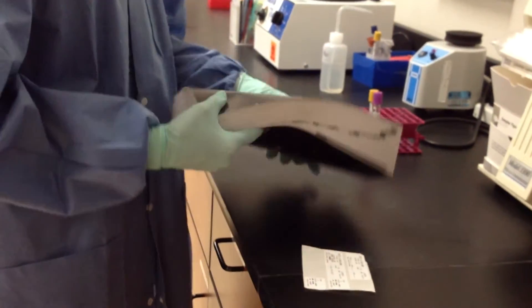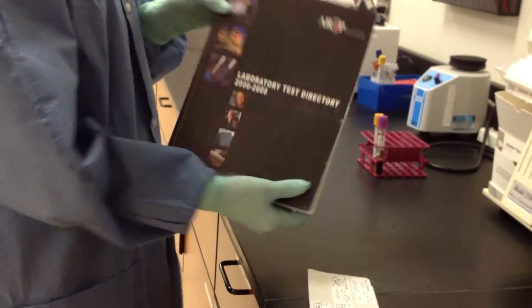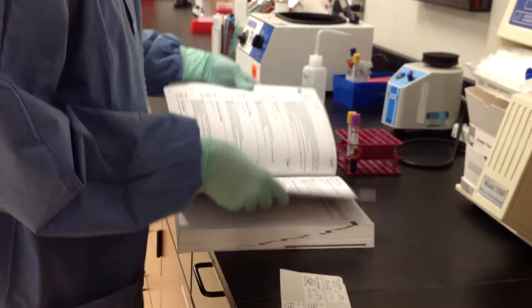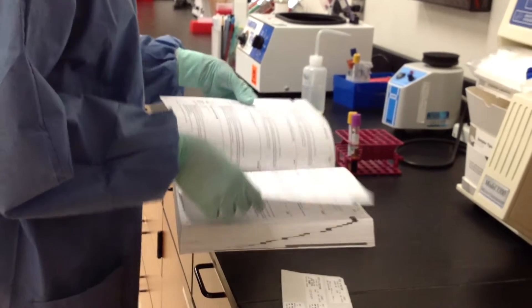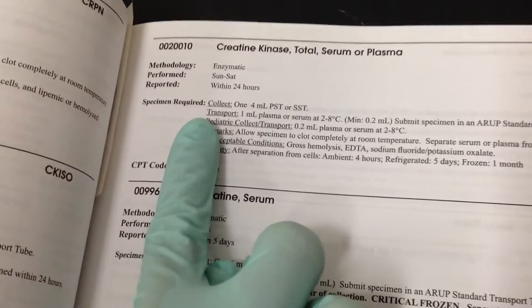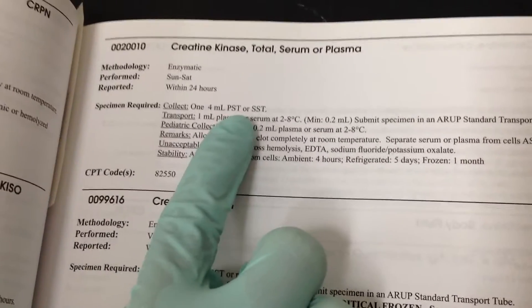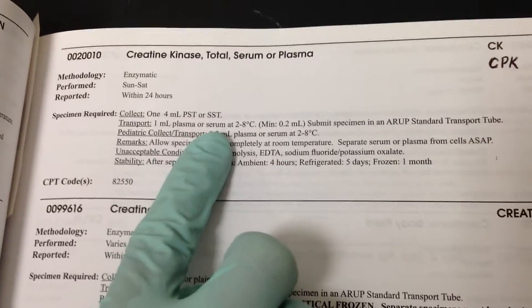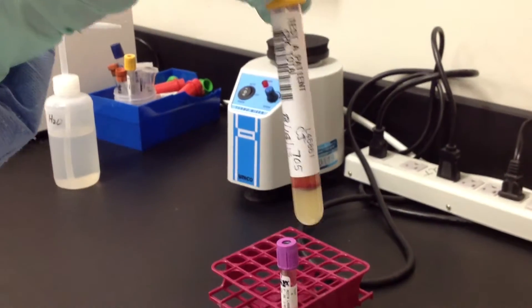We're looking at the CPK total in the test directory. We're going to find our test. We're going to look under specimen required. We need a plasma separator tube or an SST, which is a serum separator tube, so we're going to use our gold tube.